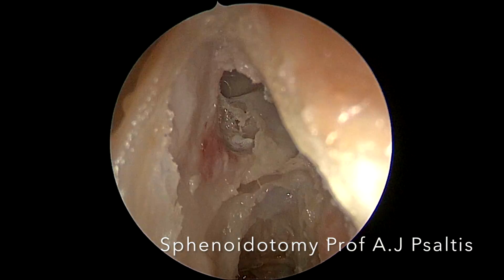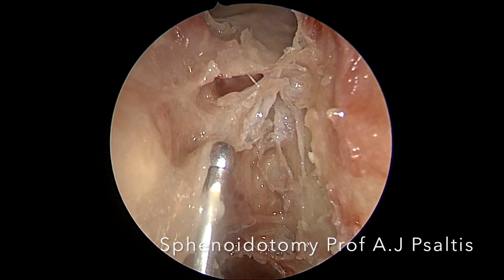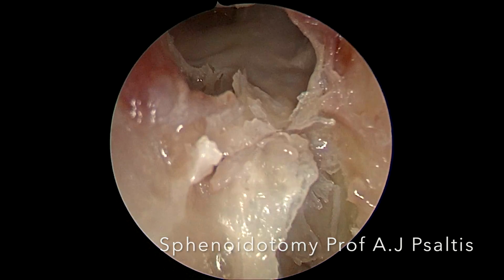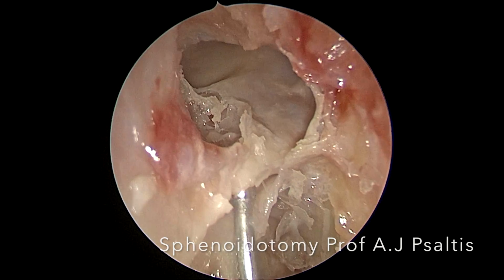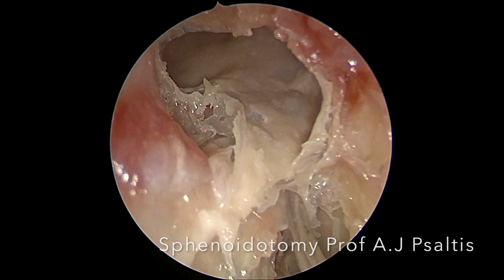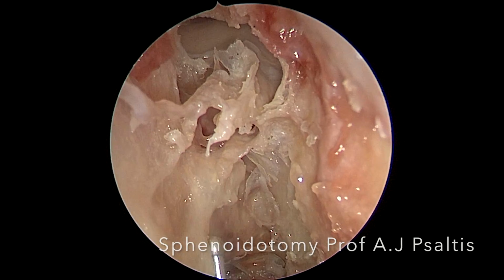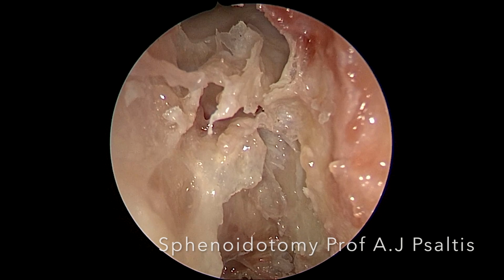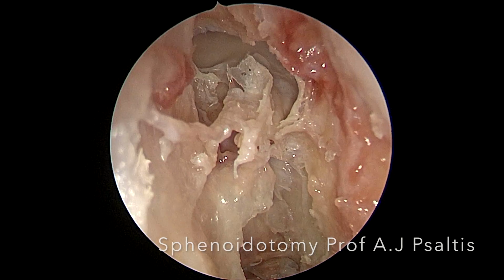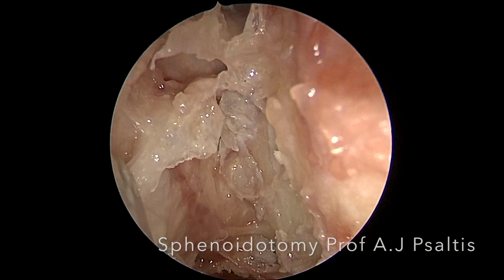Here we are changing to either a 30 or a 45-degree scope and using a probe to navigate behind the partitions and fracture them anteriorly. Note the probe is not pushing superiorly at all. It's safest to approach these remaining partitions by navigating behind them rather than pushing through them. The partitions are fractured forward, and they can then be removed with a combination of grasping instruments or a microdebrider.